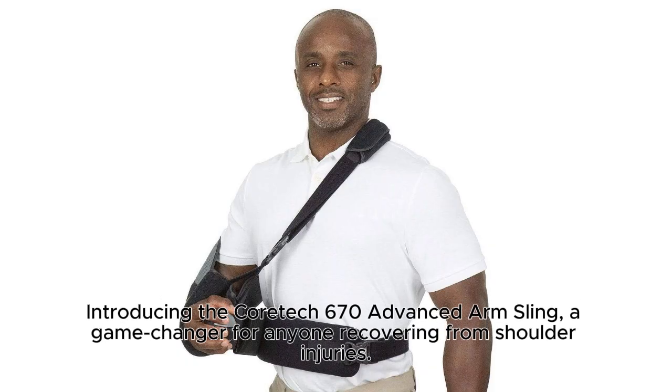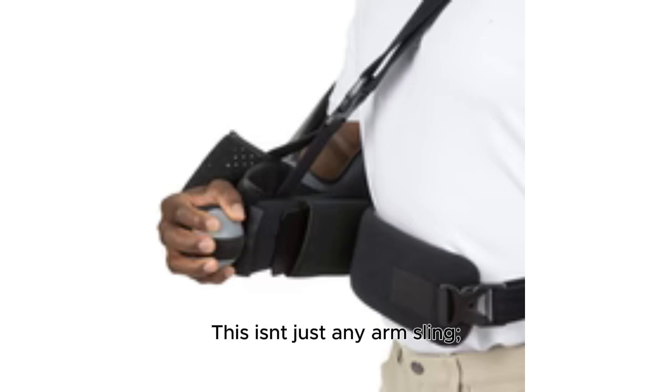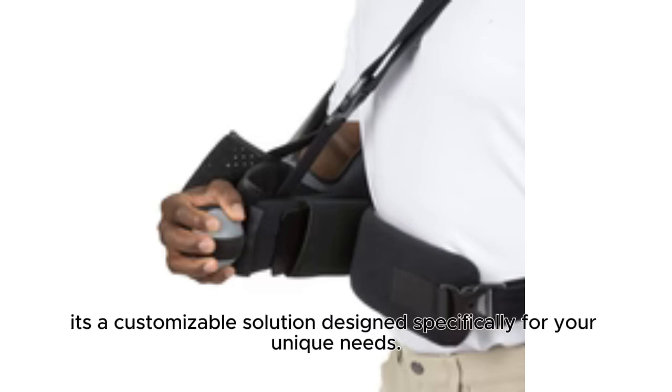Introducing the Coretech 670 Advanced Arm Sling, a game changer for anyone recovering from shoulder injuries. This isn't just any arm sling — it's a customizable solution designed specifically for your unique needs.